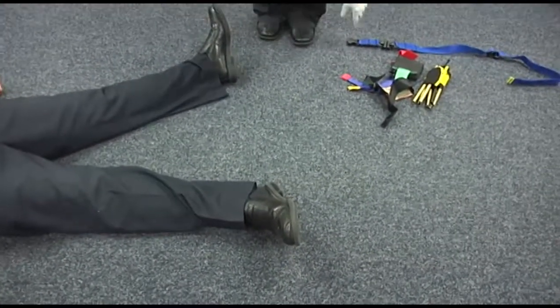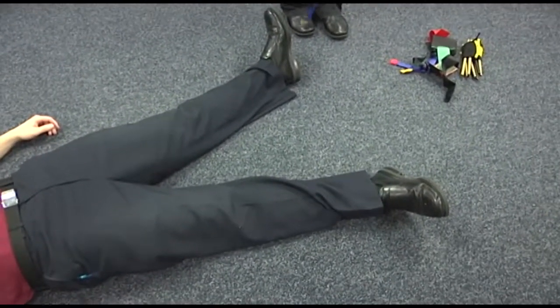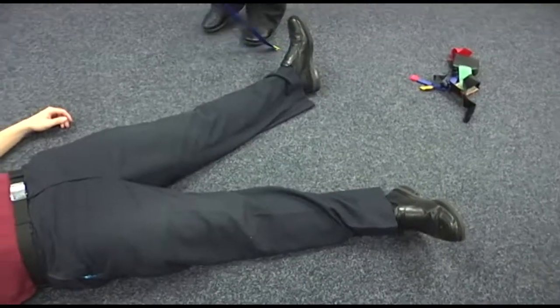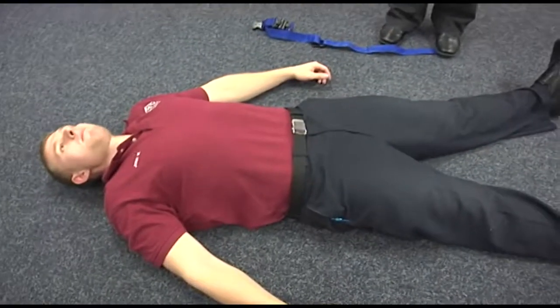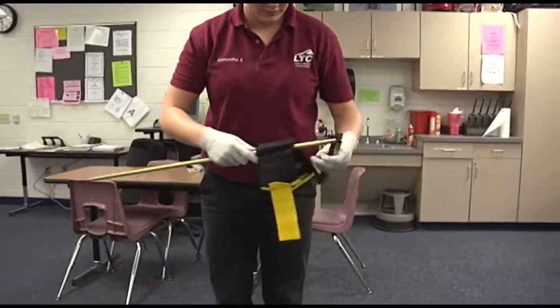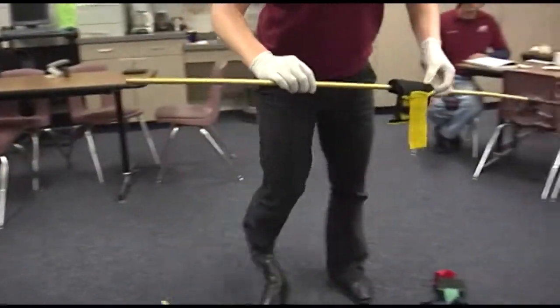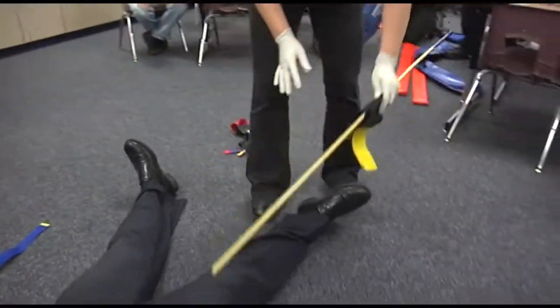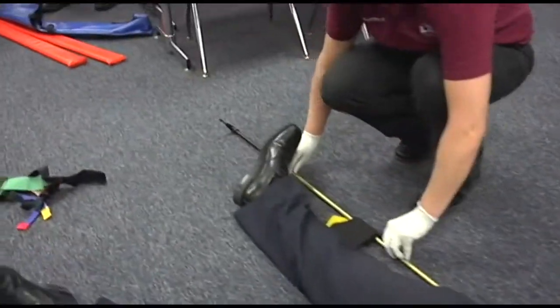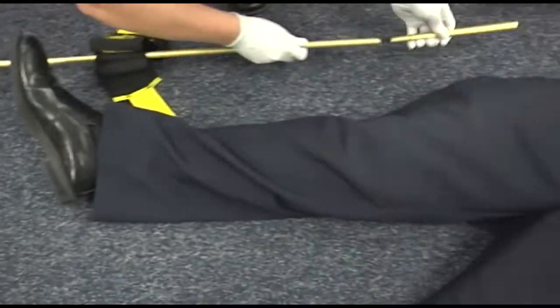Manual traction will not be needed for this because it is the KTD. You will prepare and adjust the splint to the correct length. You'll measure it so the black lower end of the splint falls below the foot, so you're going to want to shorten it one because you only want the black below that foot.